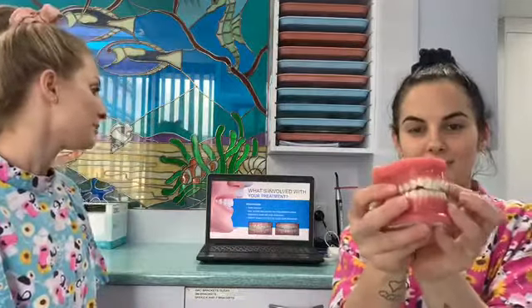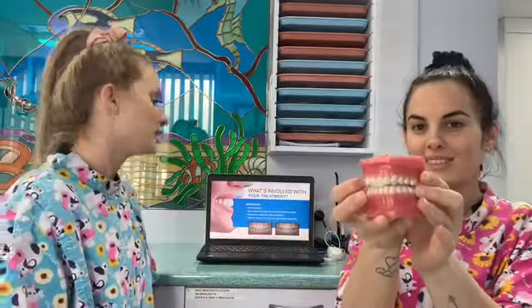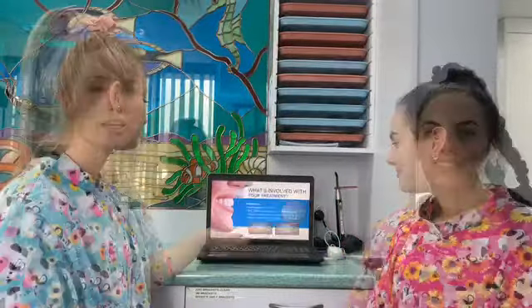So all of your attachments are tooth colored. The size, position and quantity all vary from patient to patient and they're all required to assist with your tooth movement. So some patients are required to wear elastics throughout their treatment and this is just to help correct their bite. So we'll go into more detail if we do ask you to wear them, but if we do ask you, they need to be in your mouth all the time.